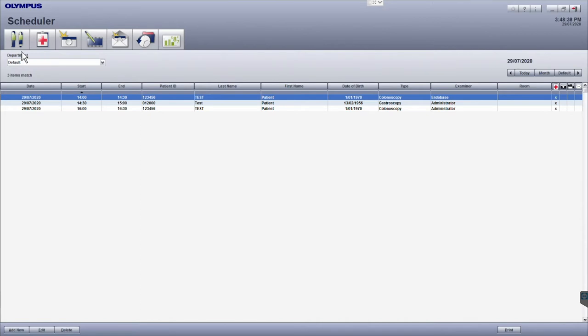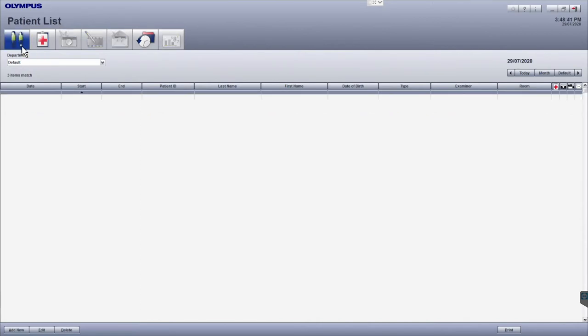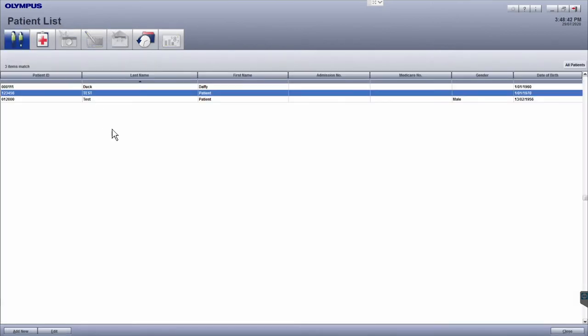The first icon on the far left, which has the two patients on it, takes you to the patient list module. Here, you can search for, create or edit patient details.